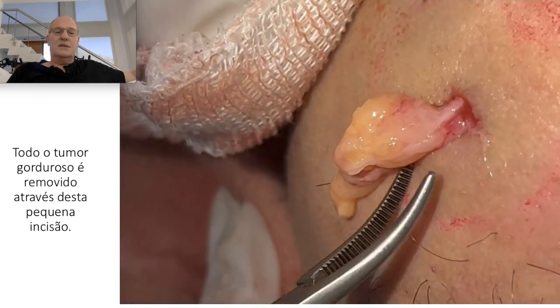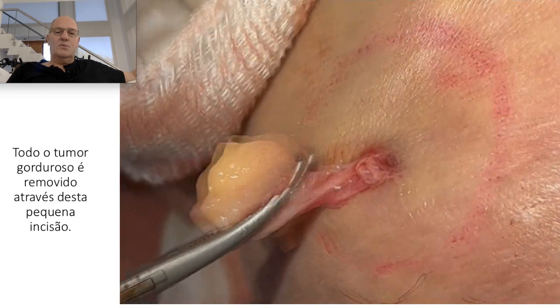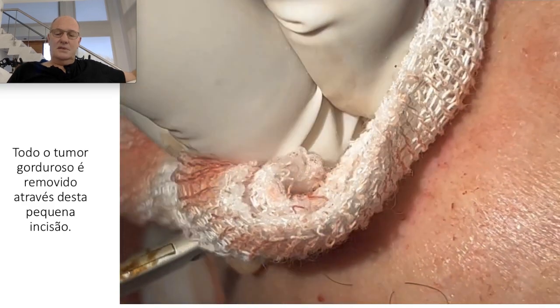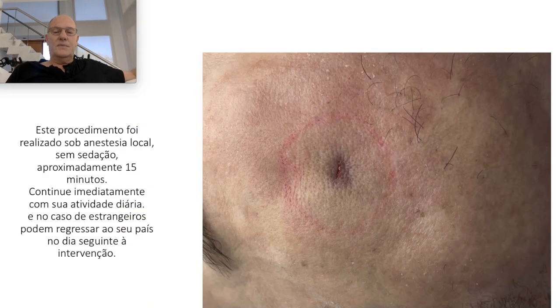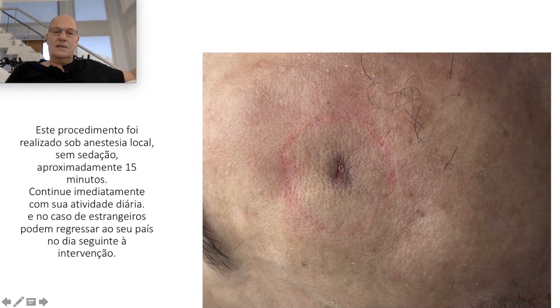The tumor is very big and was removed entirely through this incision. This is the patient after the procedure — we can see the flattening of this area.